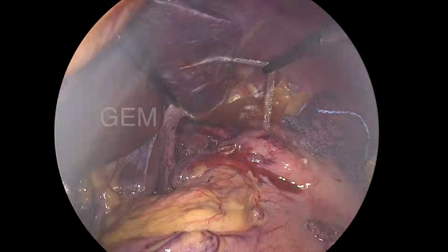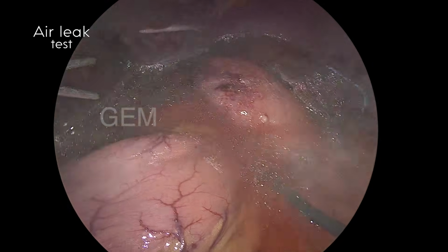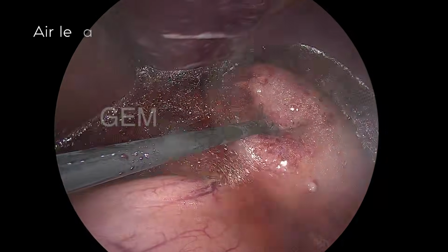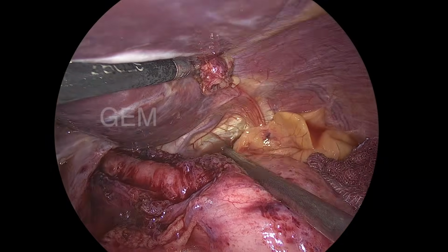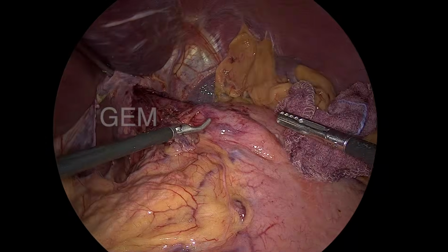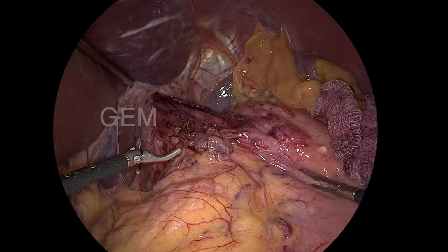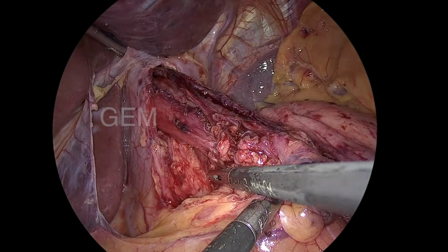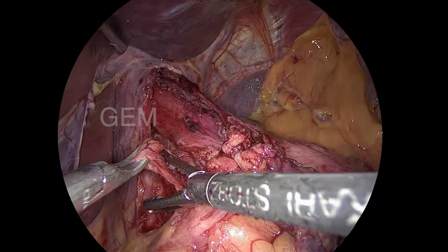Now, this is the time for the air leak test. Since the Ryle's tube is inside the stomach, I ask the sister to push air into the stomach. You can see air is coming inside the stomach fundus, there is no leak. I am not doing an endoscopy regularly in cardiomyotomy. Only in a redo fundoplication or redo Hellers, I do an endoscopy because the anatomy is varied and we have to look for any injury.